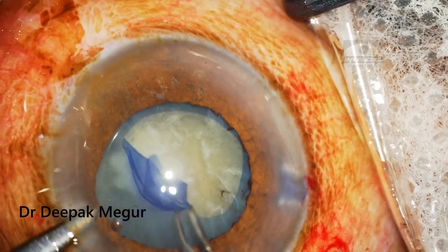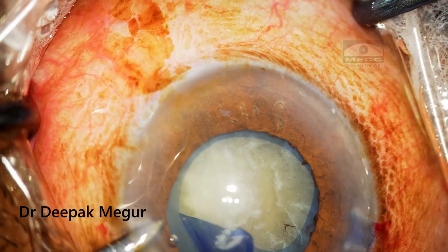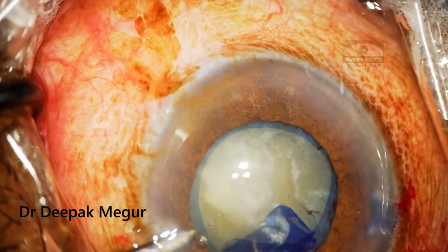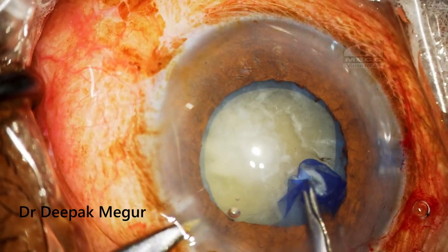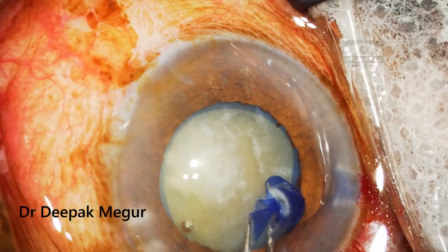Luckily, as we can see here, the rest of the capsule seems quite healthy, so performing the rhexis is relatively easy. As I am performing it, you can see that the underlying subcapsular plaque which was central has come out with the anterior capsule itself.